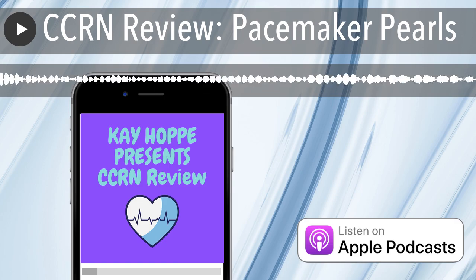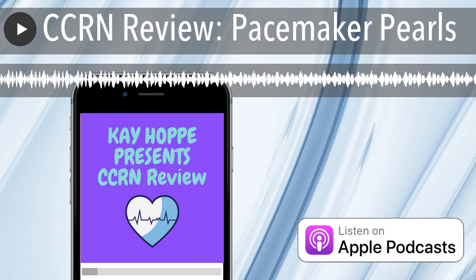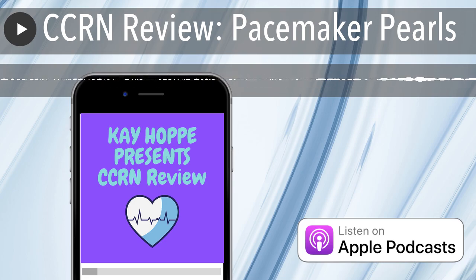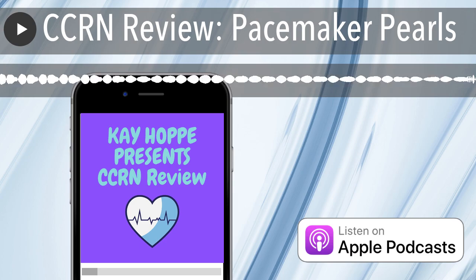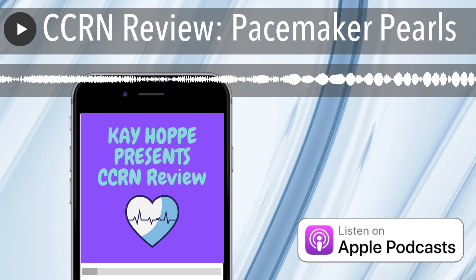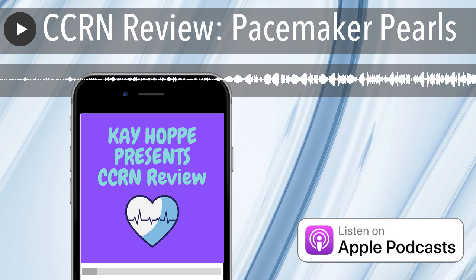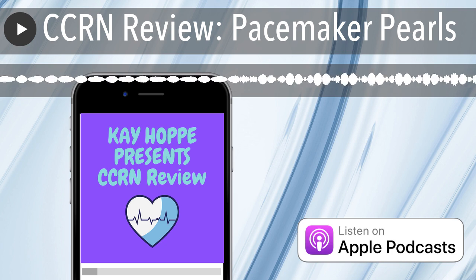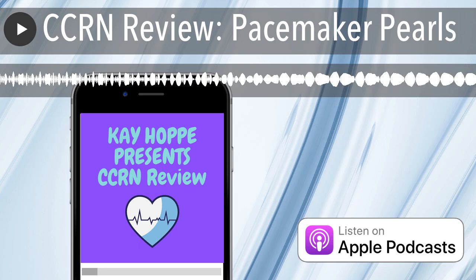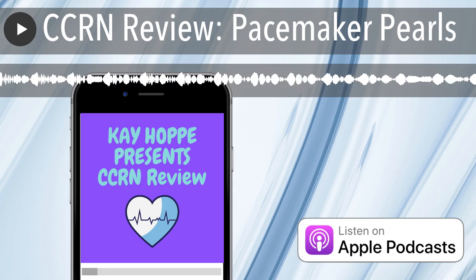underneath it. So sometimes people really get confused about the use of a magnet and pacemakers. I have heard people say, well, we use a magnet to turn a pacemaker off. And that's not true, guys. What we do with the magnet, or the effect of a magnet on a pacemaker, and of course I'm kind of going back now to a permanent pacemaker, because in critical care, certainly you could be in a situation where somebody has a permanent pacemaker as well. I'm just trying not to spend too much time on it, but this is very noteworthy.